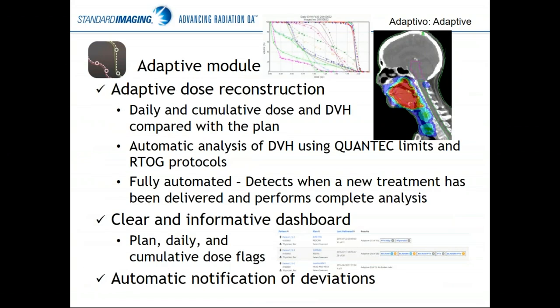The third module is where we do those 3D calculations — the adaptive module. We take the daily cone beam CT and use a deformable image registration algorithm called Morphons to map the planning image to the daily cone beam CT. We drop the contours onto that daily CT, calculate the dose, and report the daily doses being delivered. We also use the same deformation map to take those doses back to the planning image, adding together every day's treatment on that common geometry to report cumulative doses delivered to the patient. DVH analysis uses preset QUANTEC and RTOG values, but those are customizable.